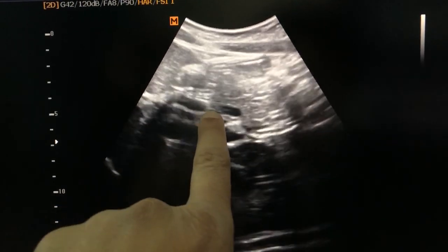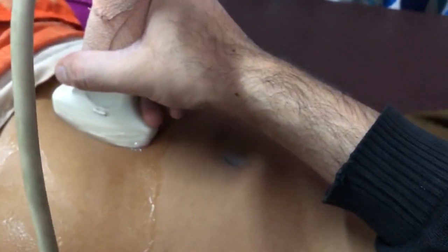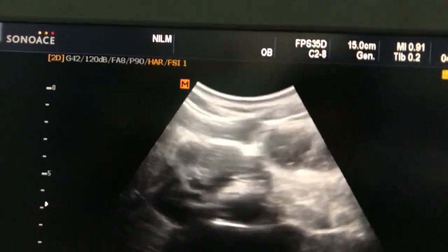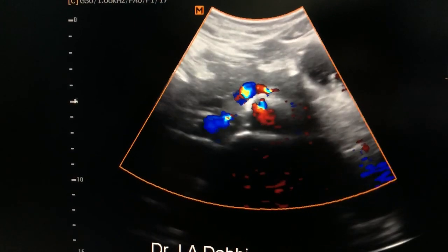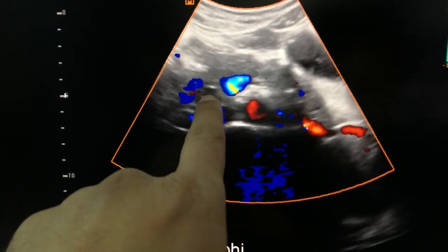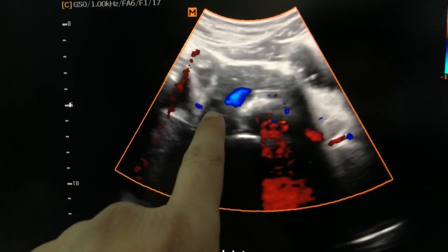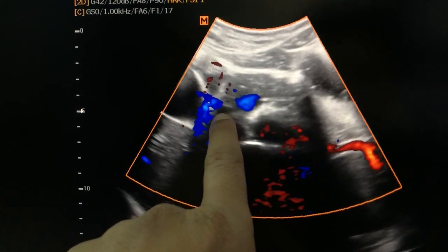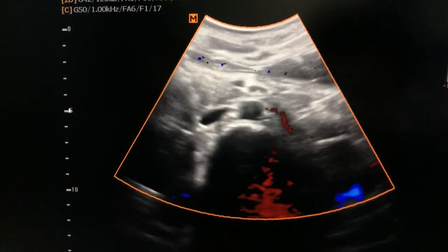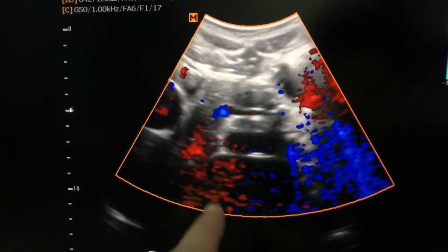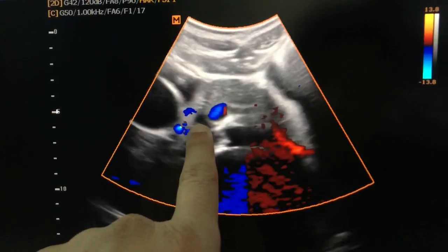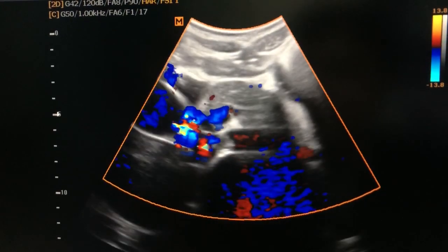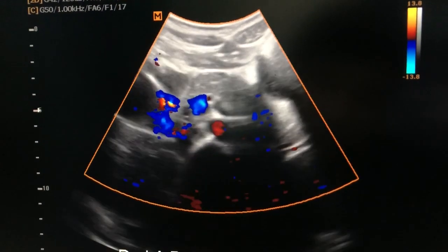This is the common bile duct. If we scan this patient in the longitudinal view for the epigastric region, this common bile duct is located at the head of the pancreas. If we scan the pancreas in the transverse view, this is the nearby terminal end where the common bile duct ends.